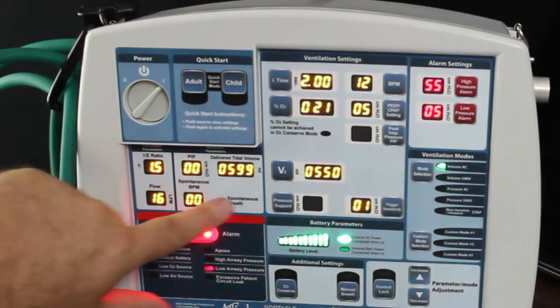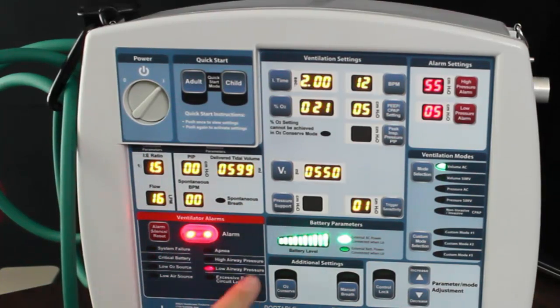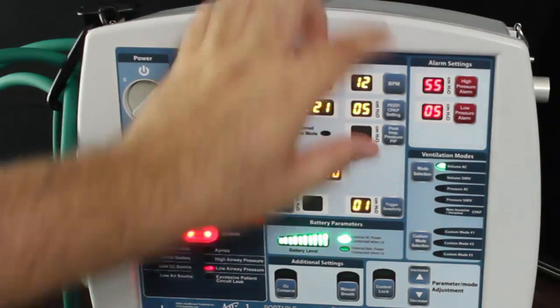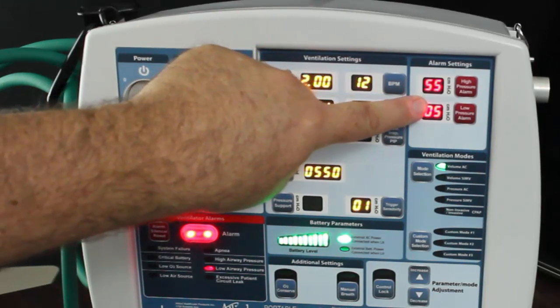This panel here shows what the patient is actually being delivered. These are your alarms. This panel shows the settings. These are the modes. This is your high-pressure and low-pressure alarms.